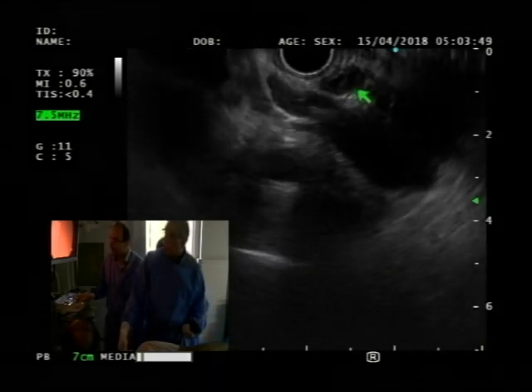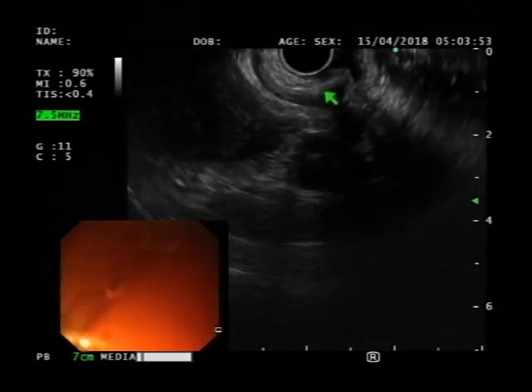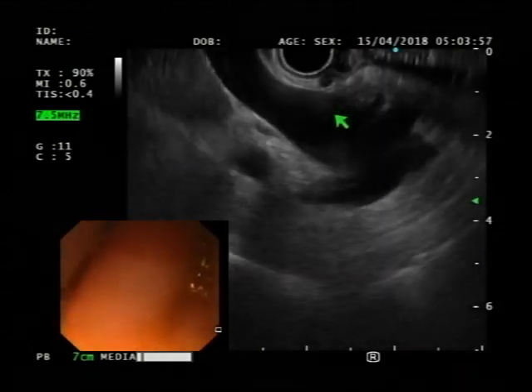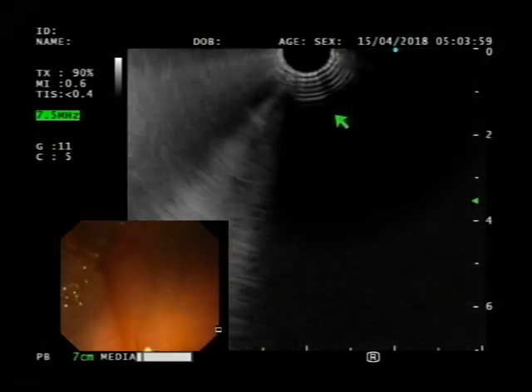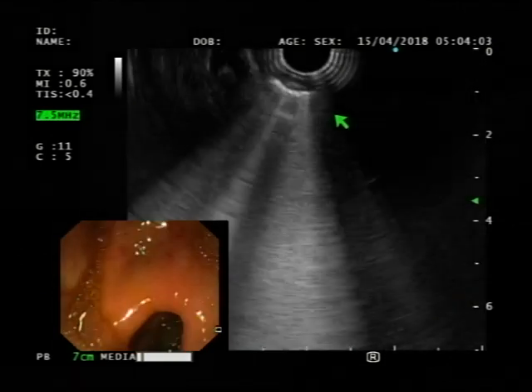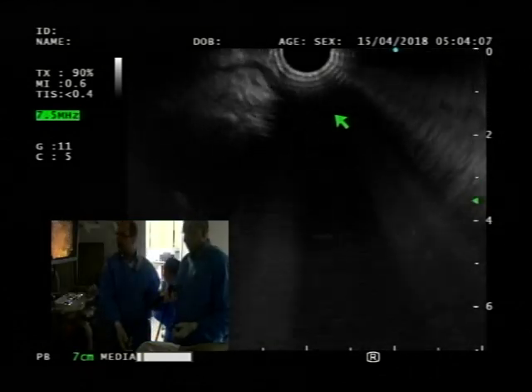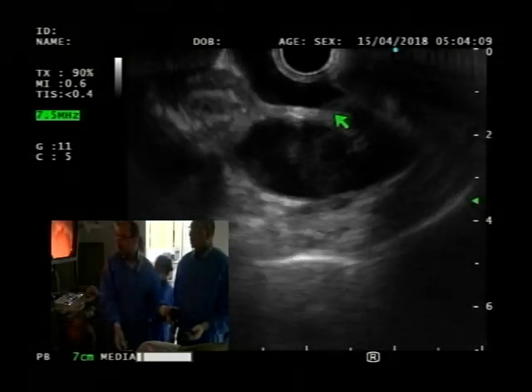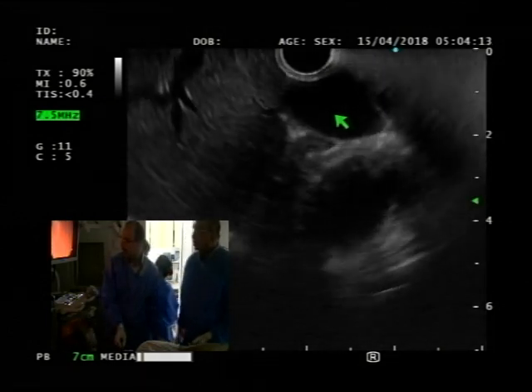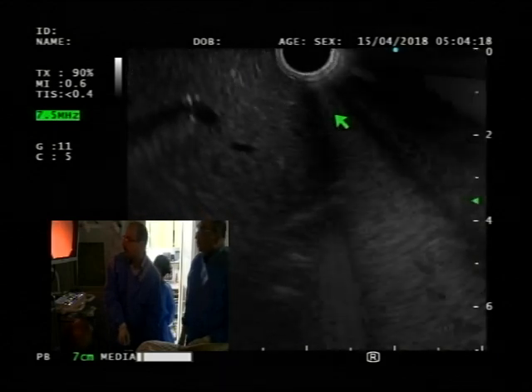There you go. And right away, you see this anechoic structure. It slipped a bit, but you had it. You actually had right kidney and right adrenal, but that's okay. So let me show you if that's okay. But you basically go in, and it's small movements. So stable, just relaxed, dropping by extending my big wheel, going counter, and as I get my liver into view, just a few things.